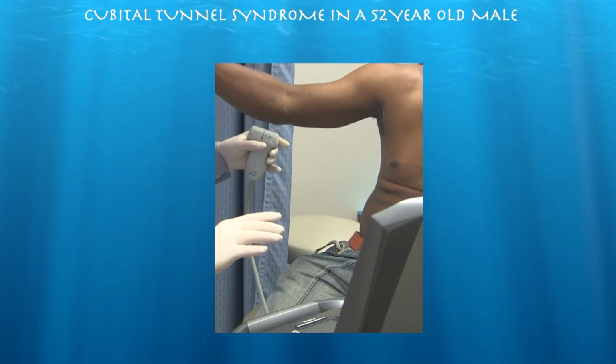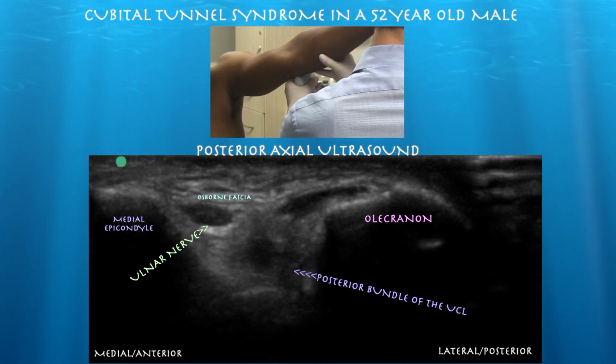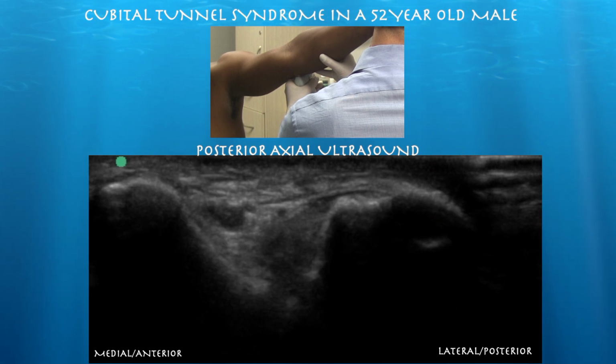Let's try to compare it to the other nerve. And here's the left side. You can see the ulnar nerve definitely looks smaller on this. Here, the ulnar nerve has a more rounded, regular type shape, and I believe it's a little bit smaller as compared to the other side.